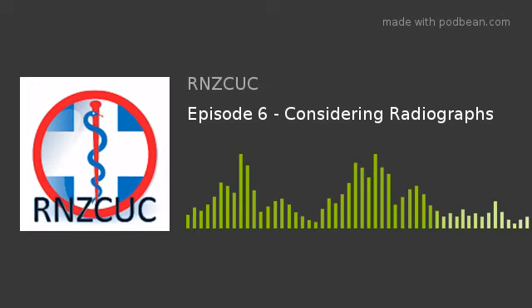So technically, you're looking for patella injury, be it dislocation, fracture, osteochondral fracture. So it's when you're specifically looking at patella injury. And I was not aware of how technically challenging they can be.